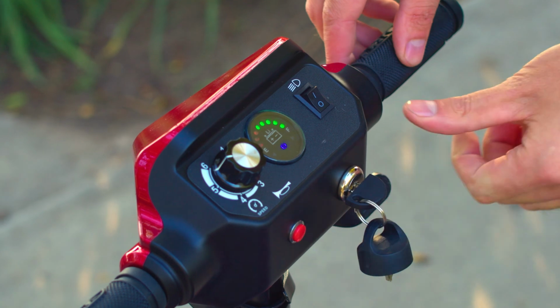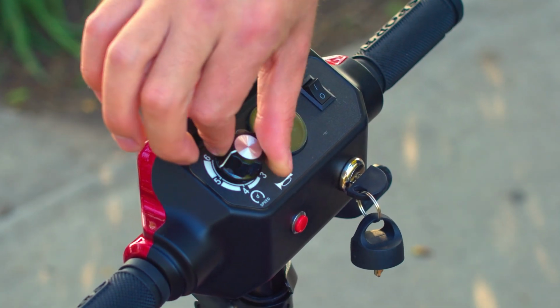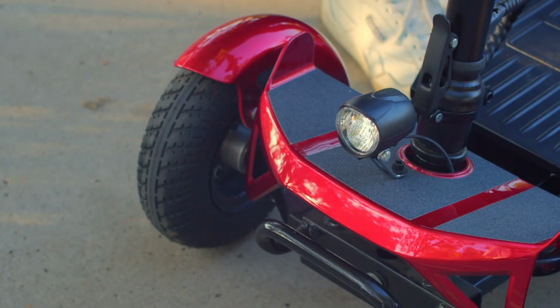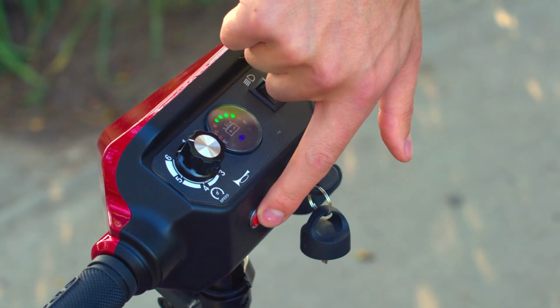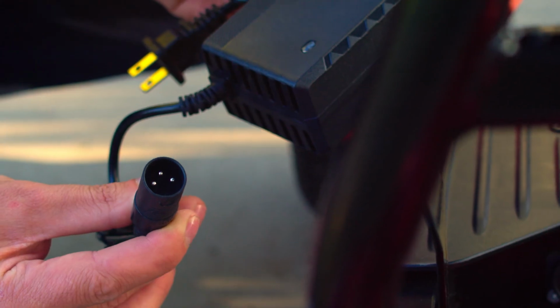And then start it on. You will see the battery power. And that is the speed indicator. That button is for lights. And that is the horn button. Before you use the scooter, make sure it is on the electric mode.